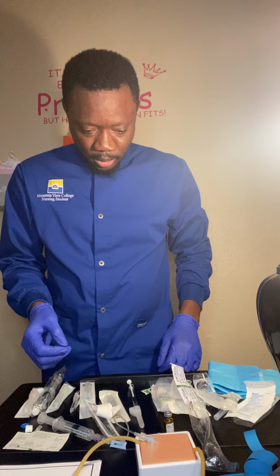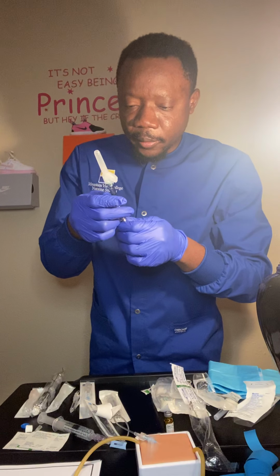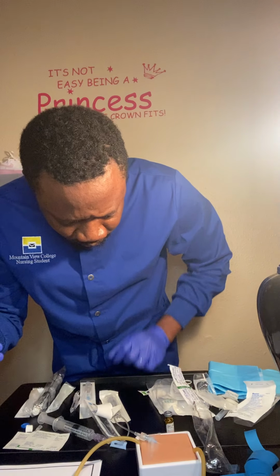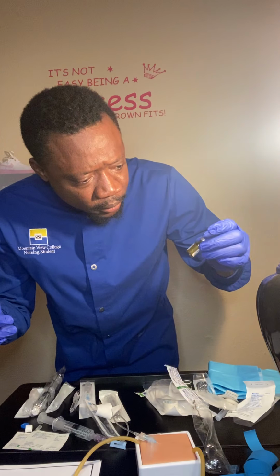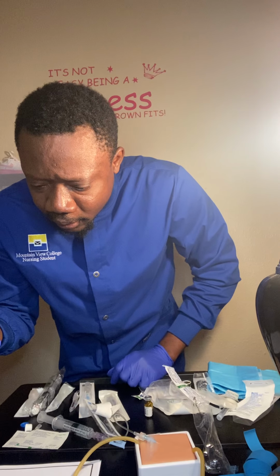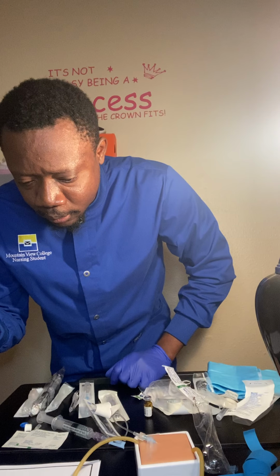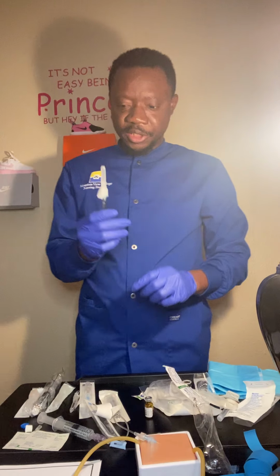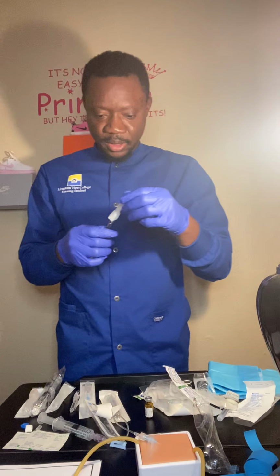So I should go ahead and do my third check. So now I have my 0.5 ml. I have my right medication, of which I already checked the expiration date is good. I do my right route, which is an IV, which I'm about to do now. I do my right patient and right time. So after my third check, it's time to administer my medication.